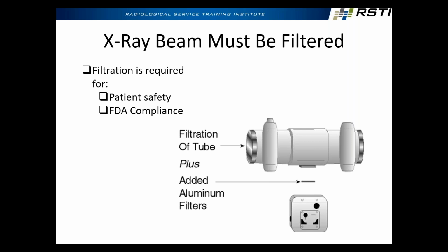Because the digital receptor can get away with a harder beam, they just use copper, right? But they use a teeny tiny bit of copper. So instead of using a millimeter or 2 millimeters of aluminum, they might use like 0.02 millimeters of copper, something like that. So that's another twist on that whole thing, is that you can use a smaller amount of a higher Z material to equal a lot of a lower Z material. All right, if that tracks.